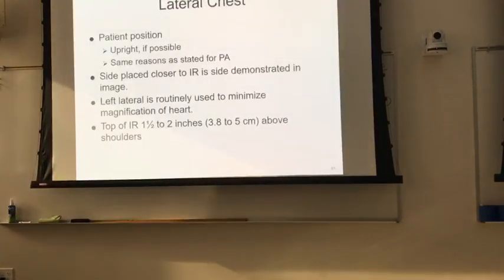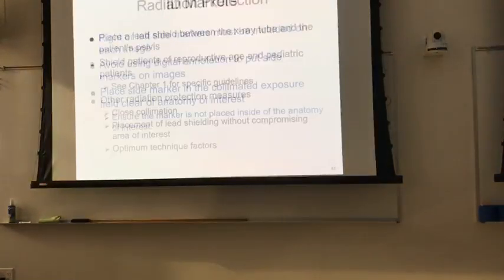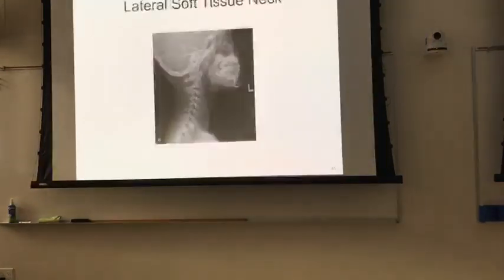All right, so lateral chest X-ray. I don't remember whether or not I really pointed this out on the recordings, but let me run through why it is that we shoot two views 90 degrees from each other.